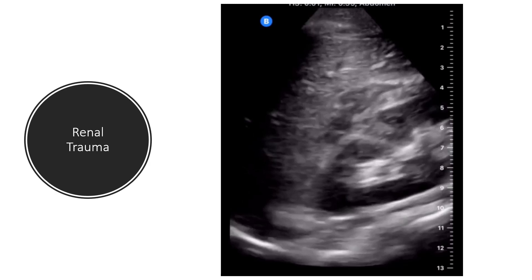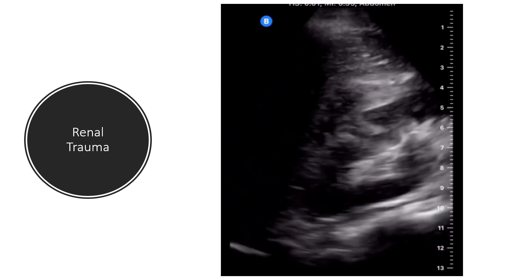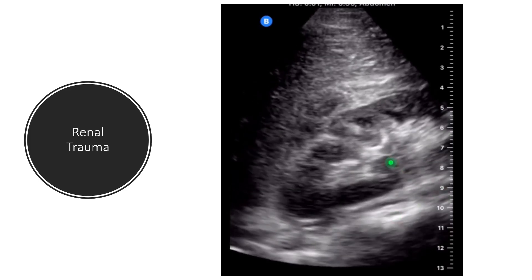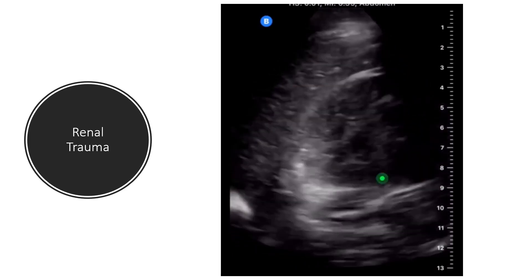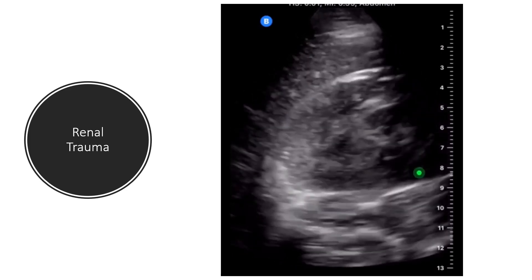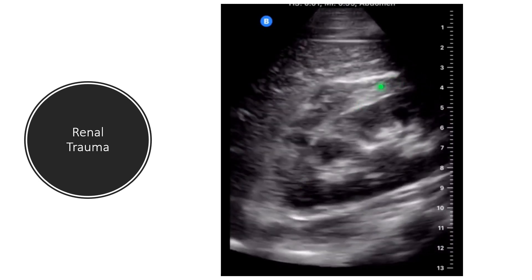Here you see a clip showing an example of a renal laceration with blood inside Gerota's fascia. This is the kidney — you don't see any cysts or anything out of the ordinary. However, you do see a mixed-density structure inside of Gerota's fascia, and this is indicative of a renal laceration.